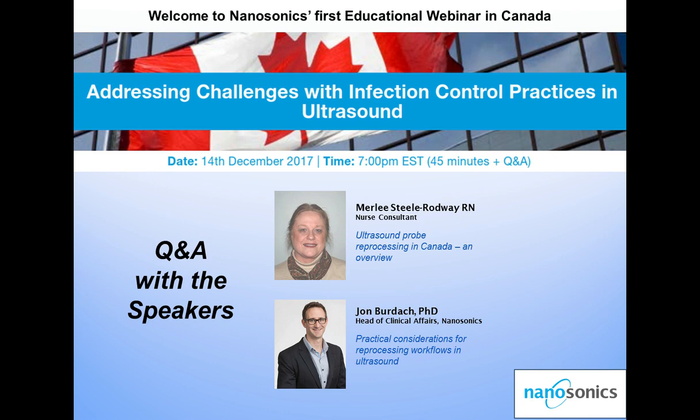There's a question here. Vaginal probes, is a simple wipe and probe cover sufficient? Physicians state that the device is inserted inside of the speculum, thus is not in contact with mucous membranes. Thoughts? So I'll have a go at answering this. I think the vast majority of transvaginal ultrasound procedures are done without a speculum, and so you would certainly expect contact with the vaginal wall during the procedure.